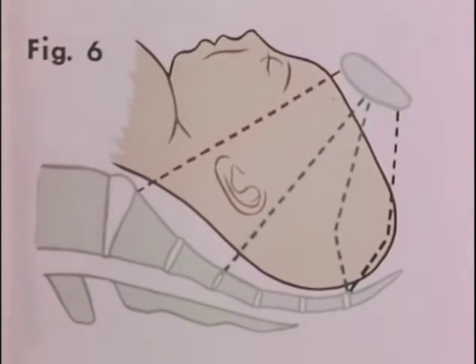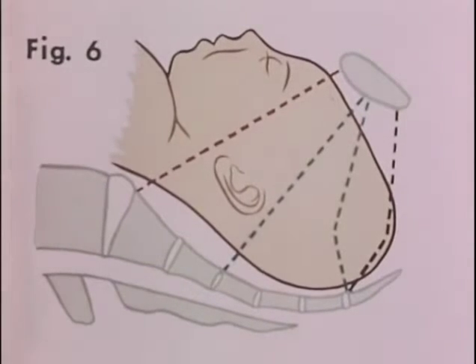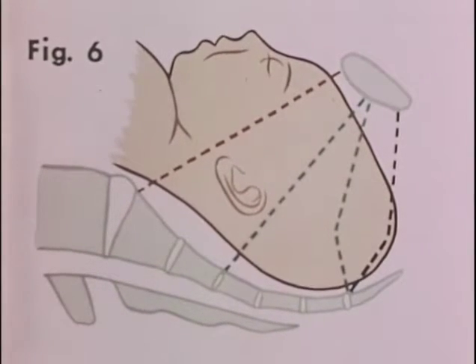The first exception to the aforementioned rules for station of the head: extreme molding. It will be noted that the leading bony point is near the outlet, but the biparietal diameter, represented by the blue line, corresponds to the level of the mid-plane, so that what might first be interpreted as a low head and would result in a low forceps, because of its molding, is actually a mid-head because of the level of the biparietal diameter.